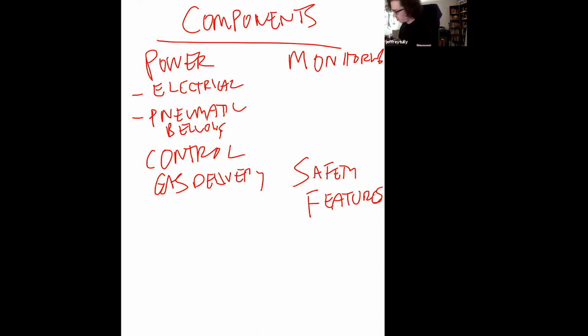Most ventilators have an ability to blend gas, so to take room air and pure oxygen and produce some desired combination if you want to try and wean your FiO2. This is something that may not be entirely essential. If you have a patient who is sick enough to need a ventilator in the current situation, they're probably in most cases going to benefit from 100% FiO2.